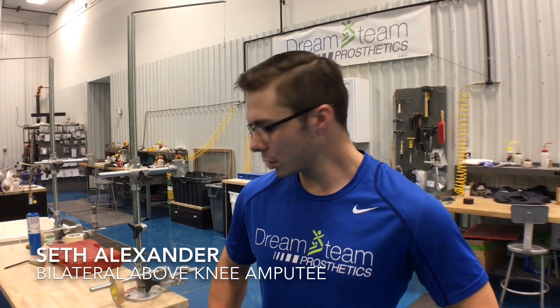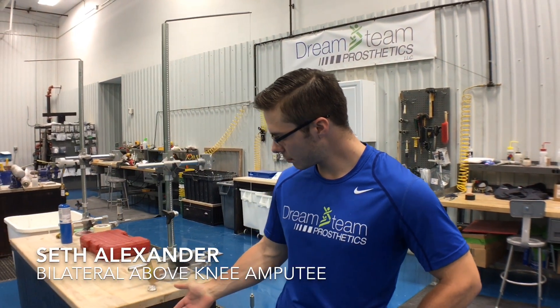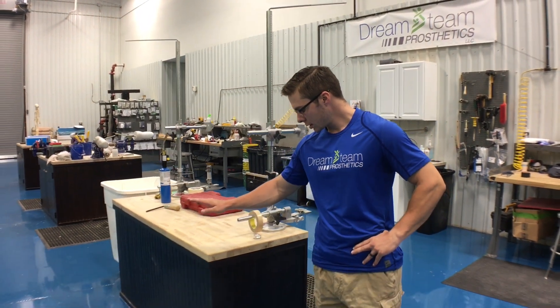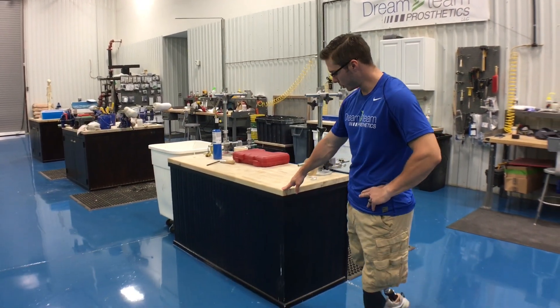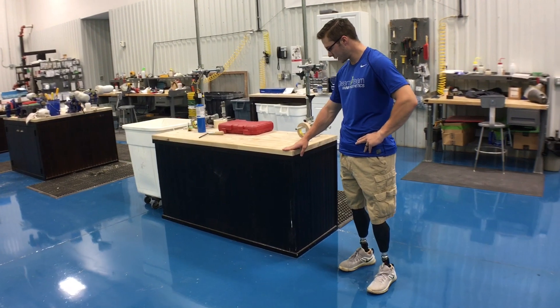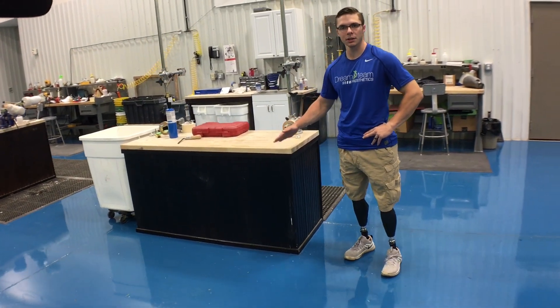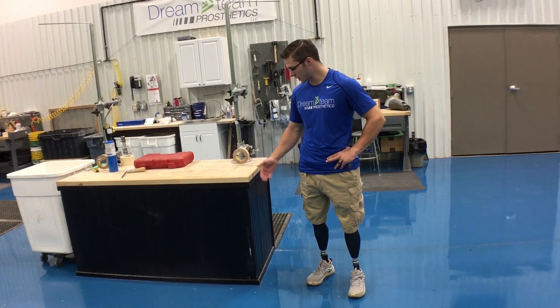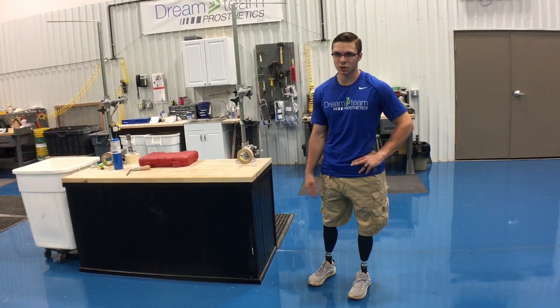Hello everyone. I'm just going to go over some stuff today that people struggle with. The biggest thing is getting on the floor with one knee, and I'm going to show you a couple different ways to do that. The first thing I like to start off with is utilizing something around you, such as a piece of furniture or in this case a bench or tabletop.